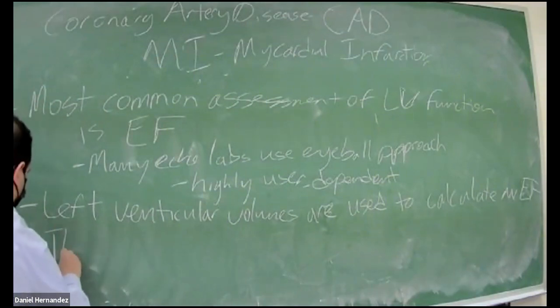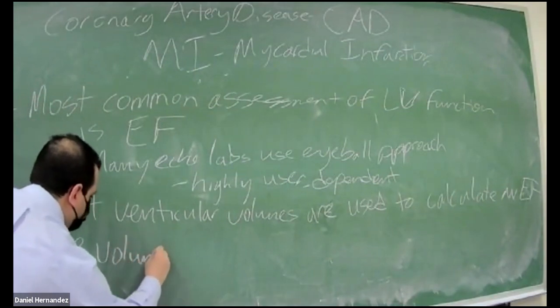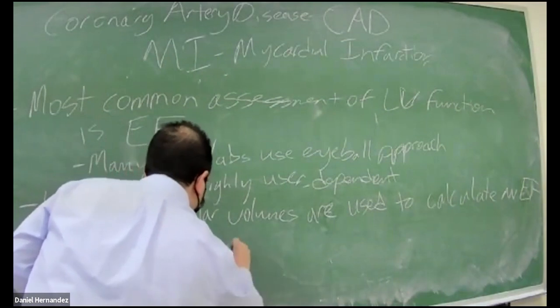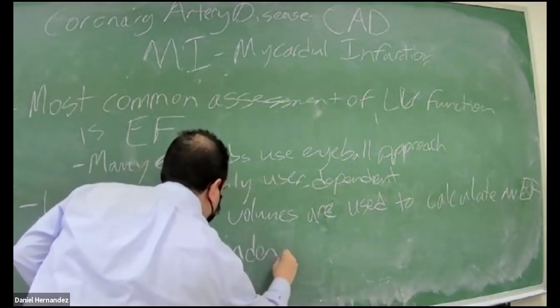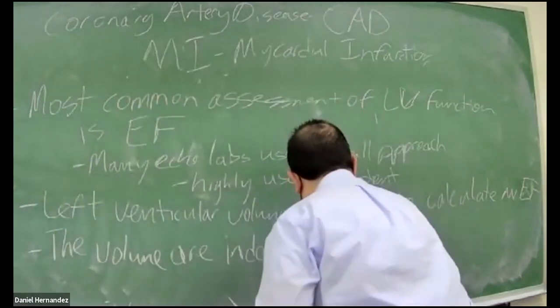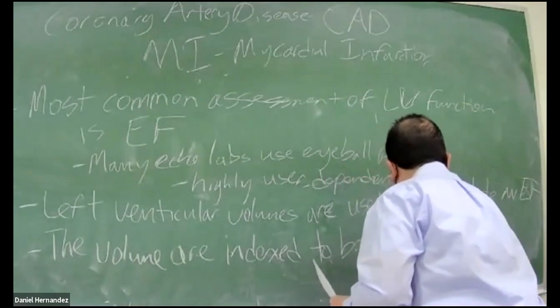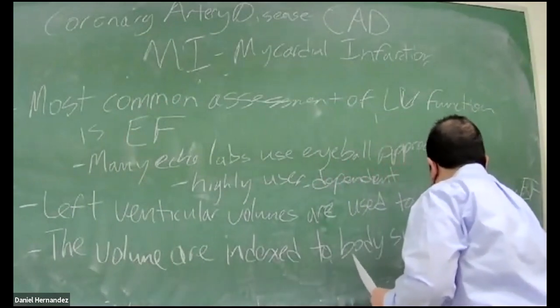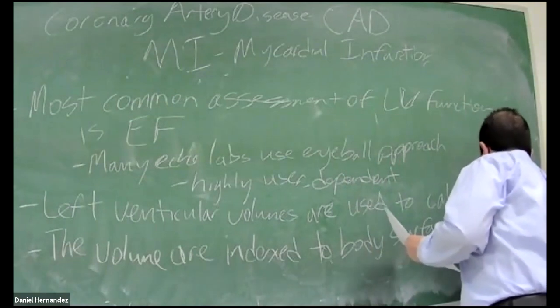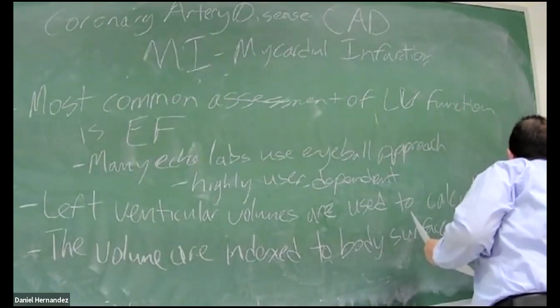And then the volumes are indexed to body surface area, or BSA.